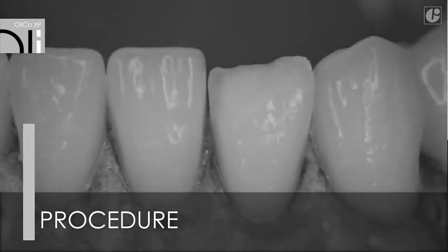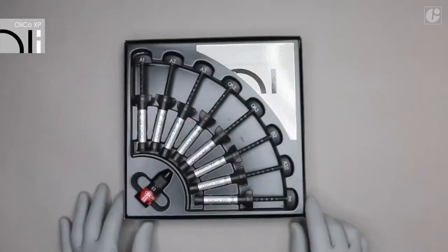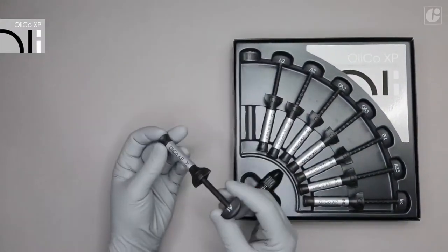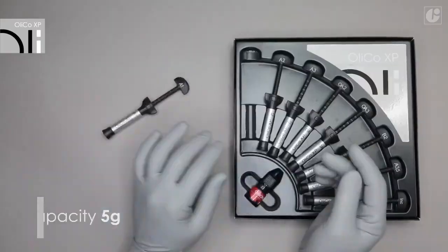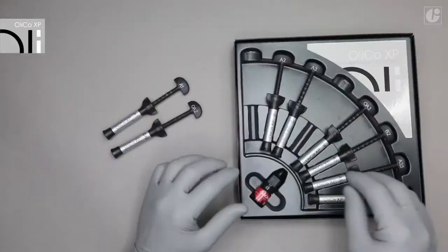Reconstruction of tooth 3-1 using OliCo XP in the Total Etch technique. OliCo XP is available in single 5g syringes and in sets with a desired bonding system.